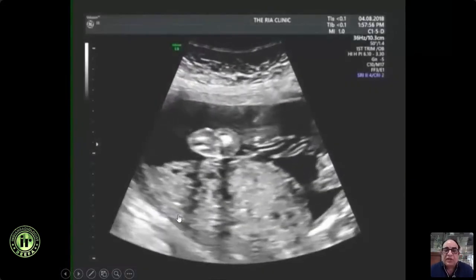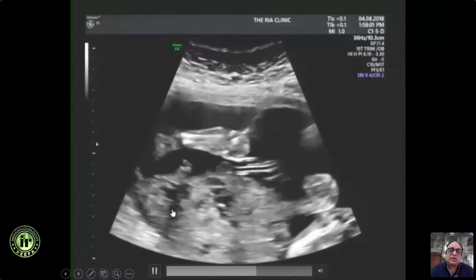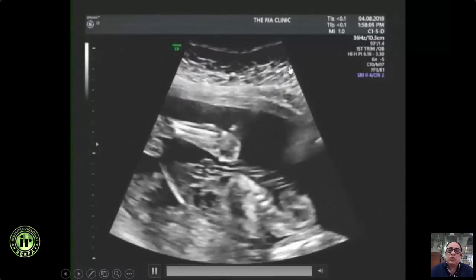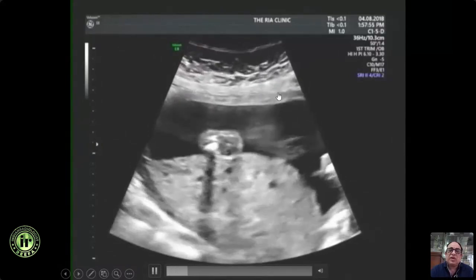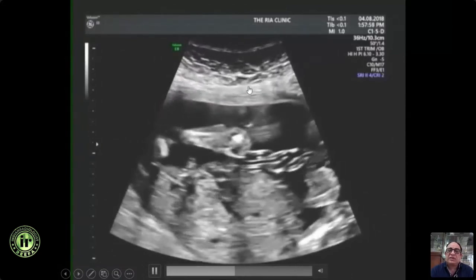Now, this was a fetus with multiple cysts or a hydropic degeneration of the placenta. And you can see that when you do an amniocentesis, it has to be a very rapid puncture at the anterior side here, free of placenta.